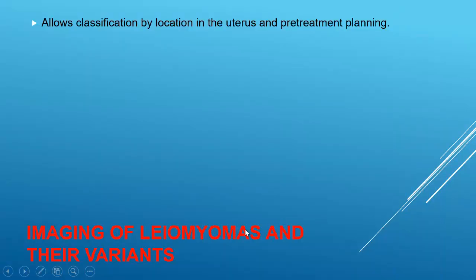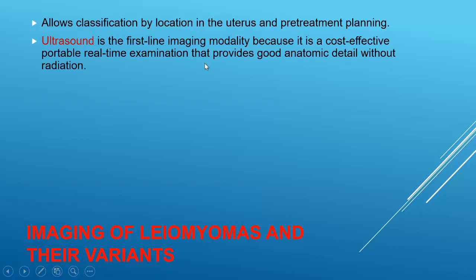Then we came to the imaging of leiomyoma and their variants. What is the role of imaging of leiomyoma? It allows classification by location in the uterus and the pre-treatment planning. يبقى الimaging, the main role is the pre-treatment planning.